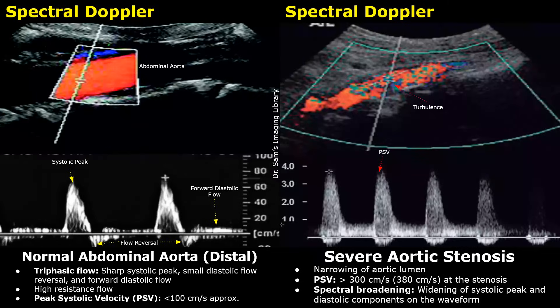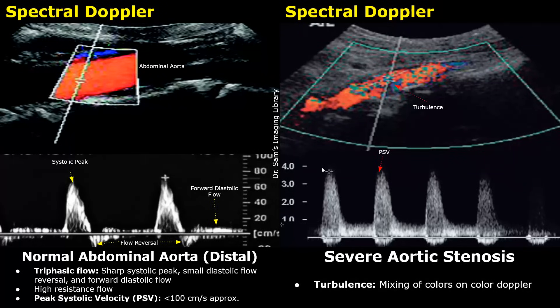In severe stenosis, the PSV will be greater than 300 cm per second. In the graph, the unit is meters per second — the PSV here is 3.8 meters per second, which is 380 cm per second, so it is very high. You can also see turbulence at the site of stenosis, with a mixing of red and blue colors. This is because blood is moving in different directions because of the plaque, giving all these different colors.